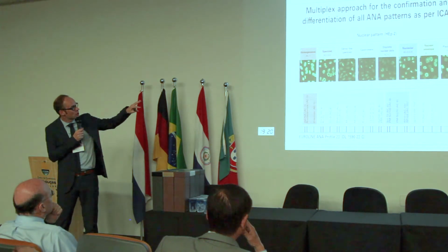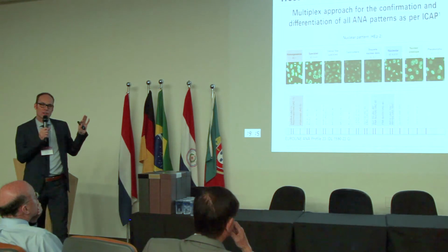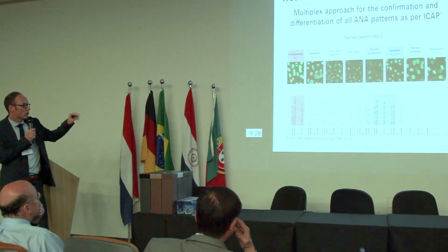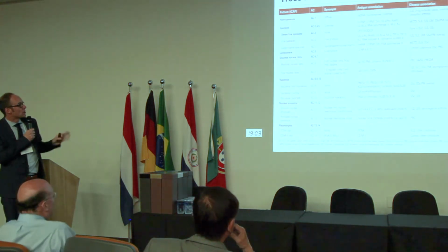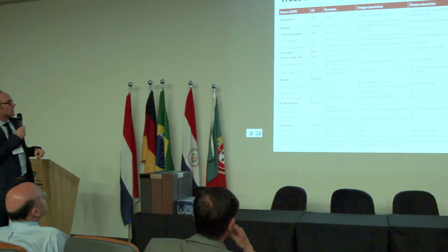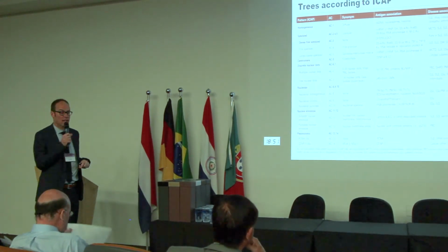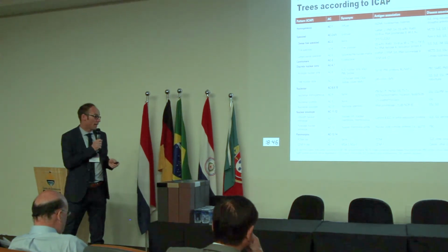to the patterns and also to the ICAP number. So we clearly state that ICAP is really part of our material also for training and also for advertisement. Also here, this is the second page of the flyer. We have the pattern on the left-hand side, the number, and then we describe the associated antigens and the disease association. And here we really directly connect to the ICAP.